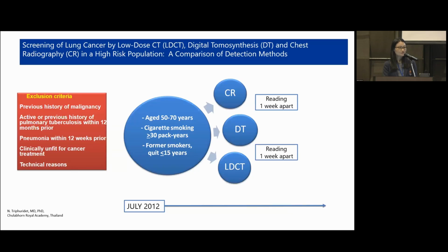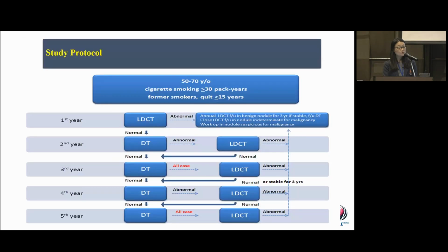But when reading, the radiologists will read blinded, 1 week apart, to reduce recall bias. And in our protocol, we use low-dose CT at baseline for every case, and also DT.